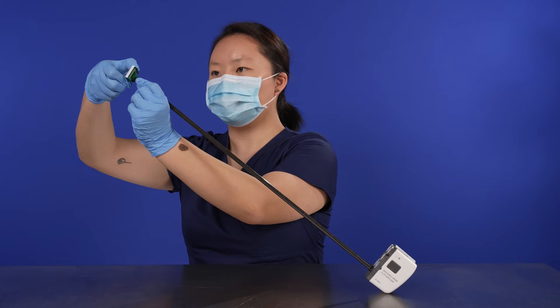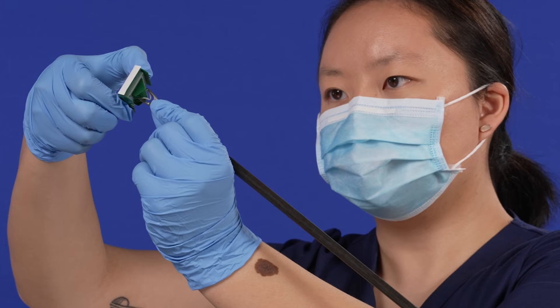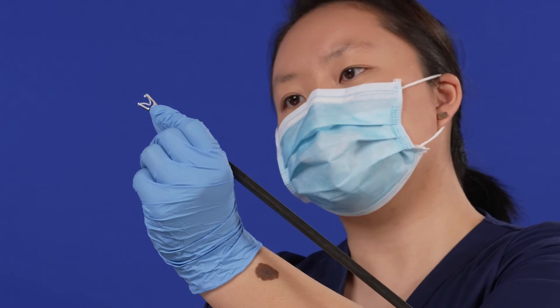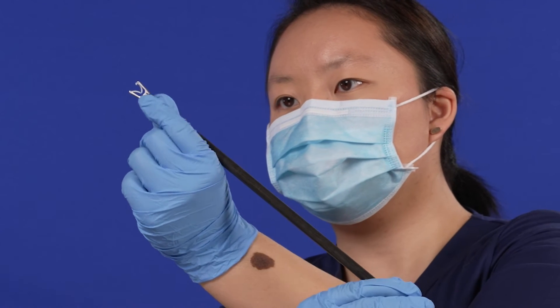Firmly press the clip into the jaws. Do not press too hard with the instrument or the clip cartridge while loading the clip, as excessive pressure will damage the instrument tips. An audible double click will be heard when the clip is loaded. Do not force the applier into the cartridge or onto the clip.